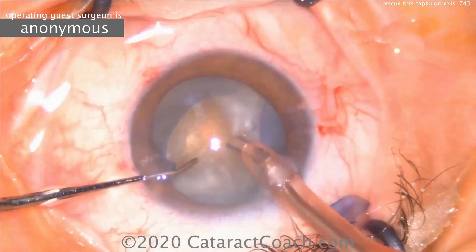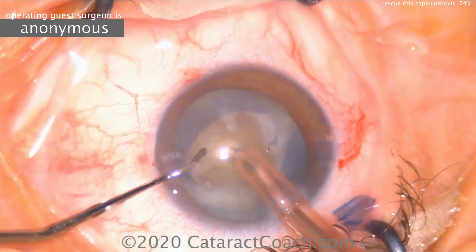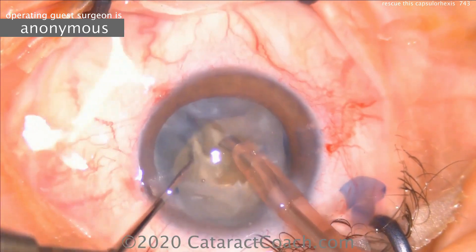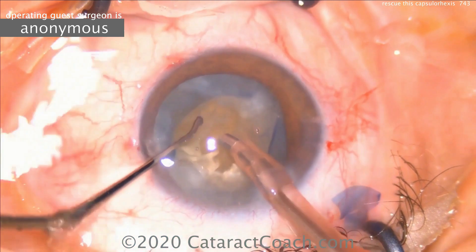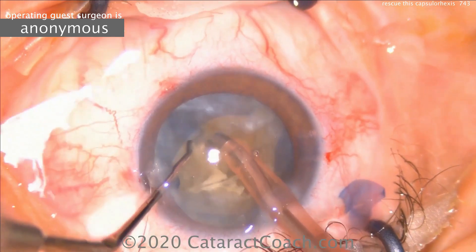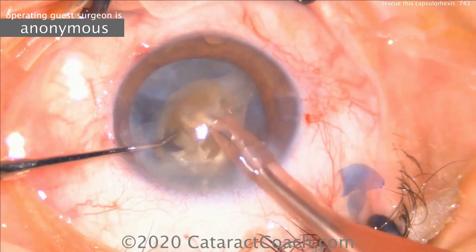Now that it's been opened up more sufficiently, care is taken to remove this nucleus without putting stress on the bag. Very important — there are two areas that are now radialized. If a lot of force is exerted on the posterior capsule, or if you push the nucleus towards the posterior capsule, that can cause sufficient pressure to cause a radialization of the tear and a wide open posterior capsule.